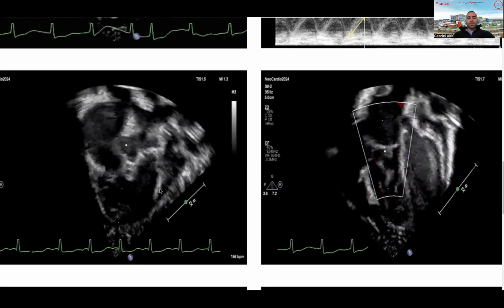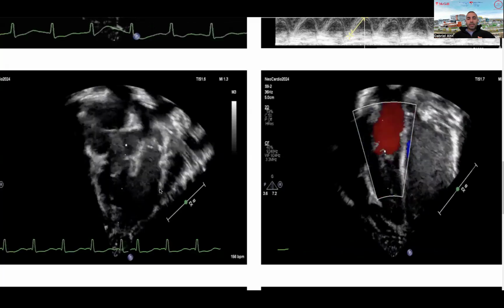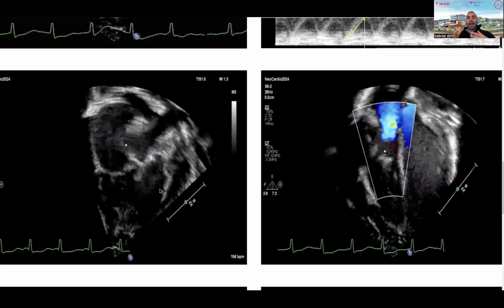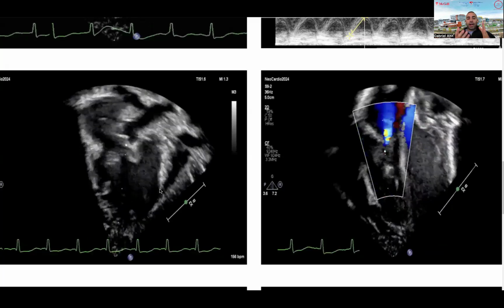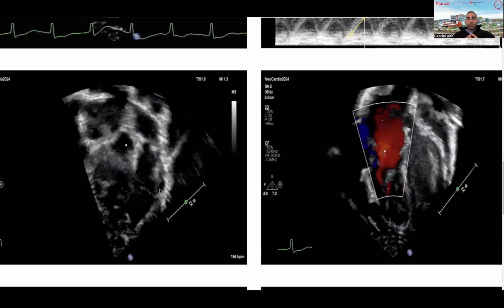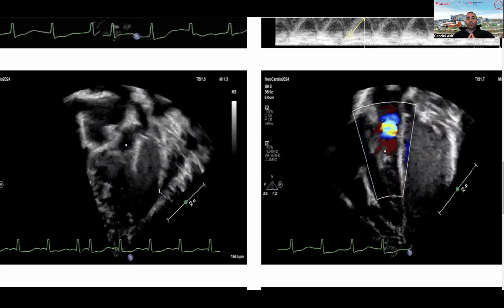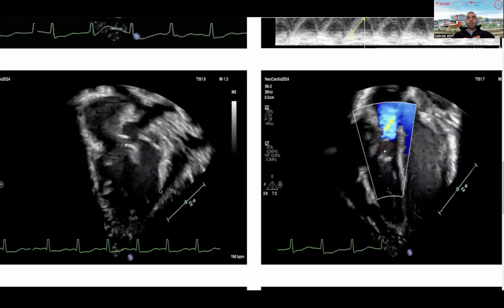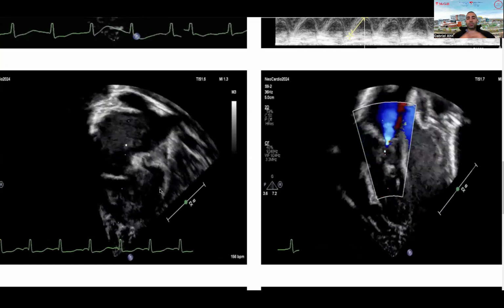It's very typical to see this in the early days of life in some of these patients after birth because of the transitional physiology. But at 36 weeks, 10 weeks later, when the PVR have dropped and typically the RV has remodeled, if the PVR are low and the patient doesn't have pulmonary hypertension or RV hypertension, the RV should look much less muscular and bulky.